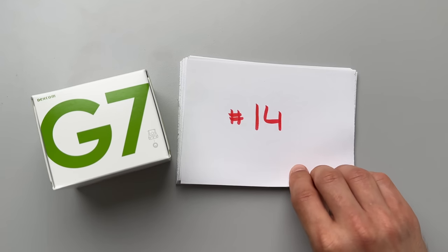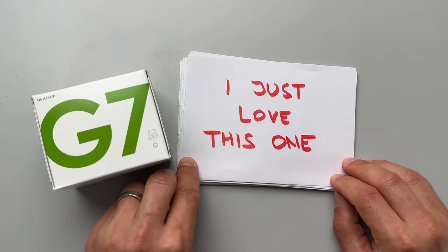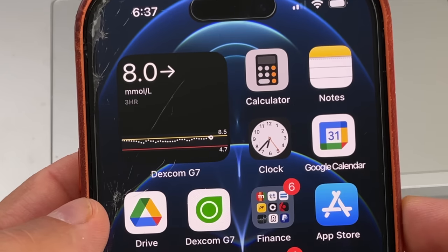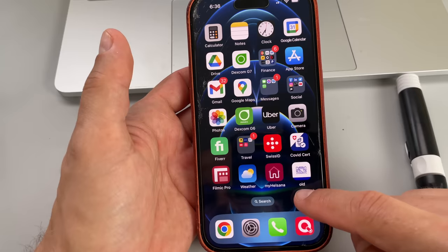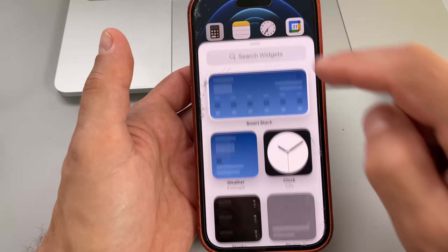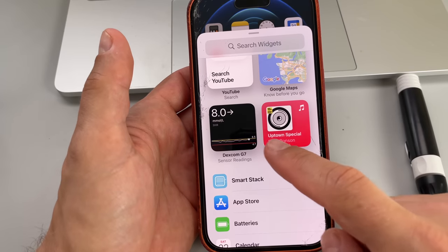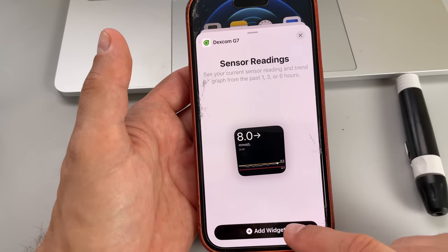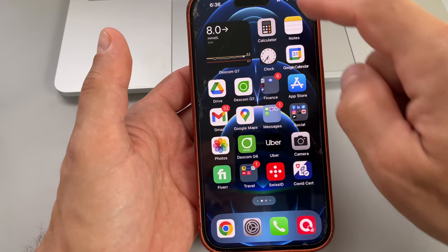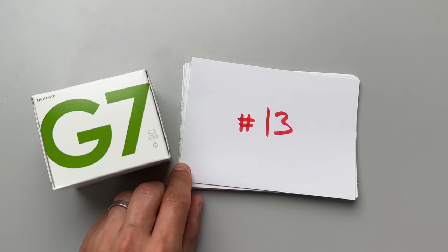Secret number 14: how to add a Dexcom G7 widget on your phone screen. The widget lets you see your glucose numbers on your lock screen or home screen without opening the app. To add it on your home screen, touch and hold an empty area, tap the add button in the upper left corner, select the Dexcom widget, tap add widget, and tap done. You can also add this on the lock screen. I'm an iPhone user so I don't know how to do it on Android, but you can Google it.